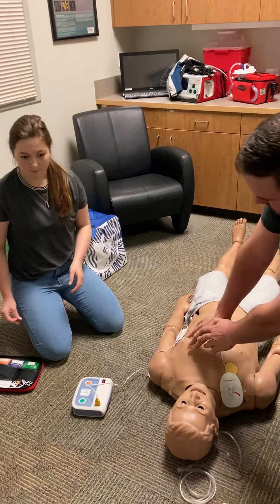Analyzing heart rhythm. Do not touch the patient. Everybody clear. Shock advised. Charging. Stay clear of patient. Deliver shock now. Press the orange button now. Delivering shock. 3, 2, 1. Shock delivered. Begin CPR.